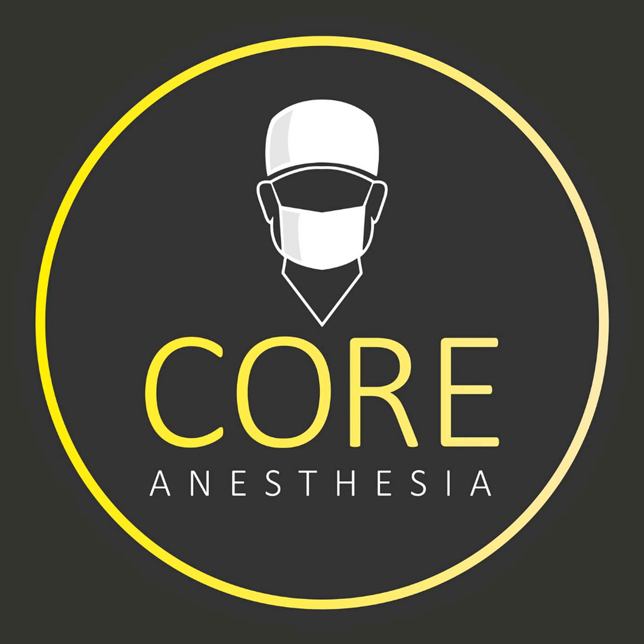Super nice device. Again, this is going to be much review for a lot of people, but I think oftentimes we forget that we have this tool. And so it's, again, just important to run over some of the basics of it. So this is going to be a supraglottic airway device. It's going to sit above or surround the glottis. The advantage to this is if you're in a sticky situation, say you are having trouble masking a patient, you're able to place this very quickly.